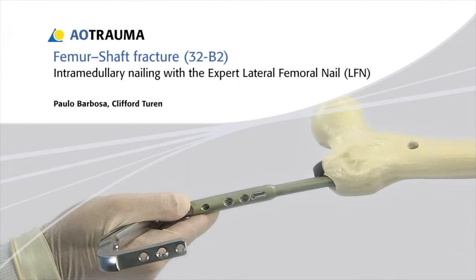In this presentation, fixation of a 3,2-B2 femoral shaft fracture will be demonstrated using the expert lateral femoral nail, or LFN.